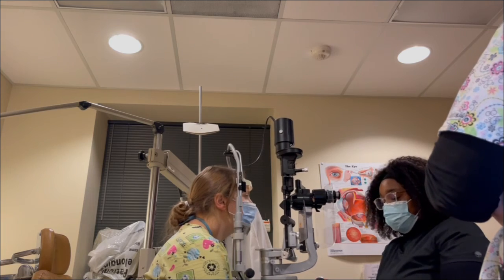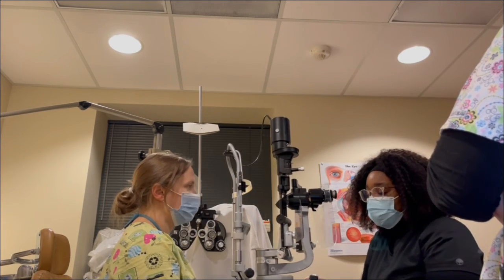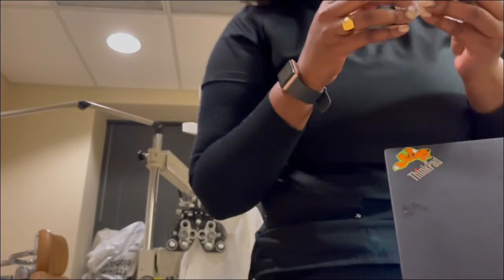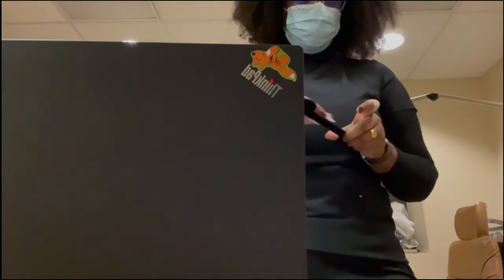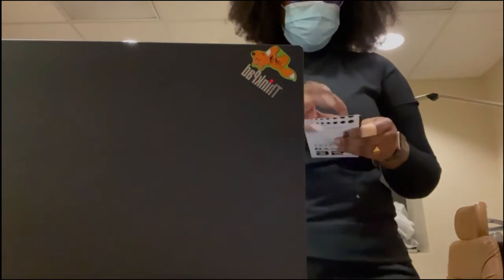This is actually my beginning stages of using the slit lamp, so I'm not that comfortable yet — that's why these ladies are training me, and they are so lovely for doing so. After I work up a patient, I let them sit here and then go get the next patient. They sit here and wait for the doctor. Right now I'm just wiping down everything because it's the end of the day, and I'm going to close up the room.